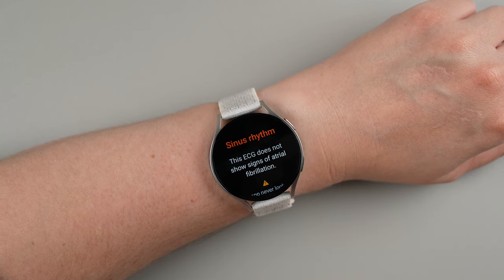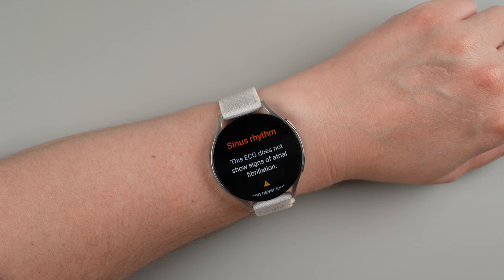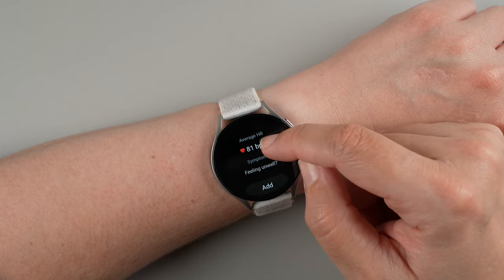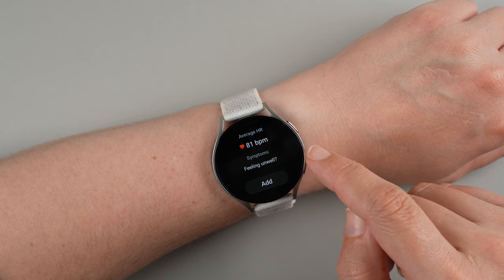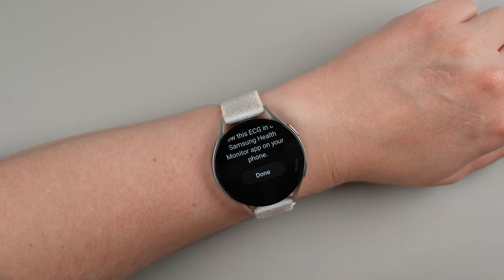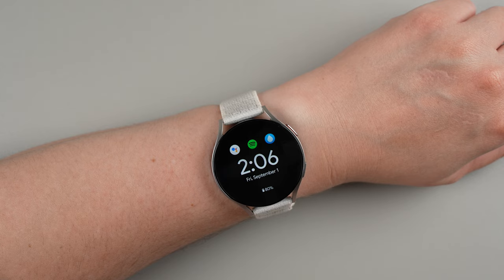So that was my very first ECG with a Samsung Galaxy Watch. I did fortunately get the sinus rhythm result, which means that this ECG does not show signs of atrial fibrillation. It will remind you again about its disclaimer, tell you the average heart rate during those 30 seconds of recording, and you can also add symptoms if you are feeling unwell. You can also view this ECG in the Samsung Health Monitor app on your phone. I'll go ahead and tap done, and to get back you can just tap the home button once.